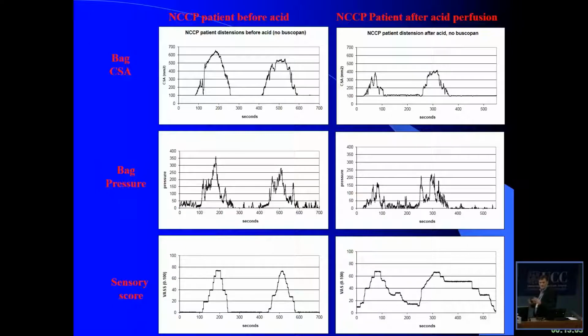This is the only example, but we also would combine this with the thermal testing, with electrical stimulation, to look at interaction between these different modalities. And that makes a lot of sense since we have different types of receptors in the esophagus wall, in the intestinal wall. Some are mechanosensitive, some are thermosensitive, some are more polymodal.